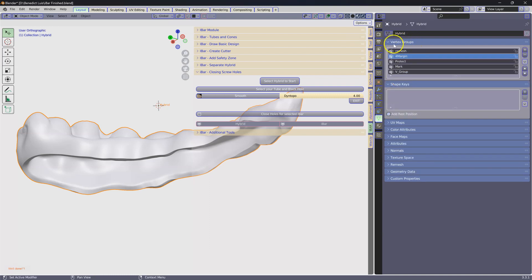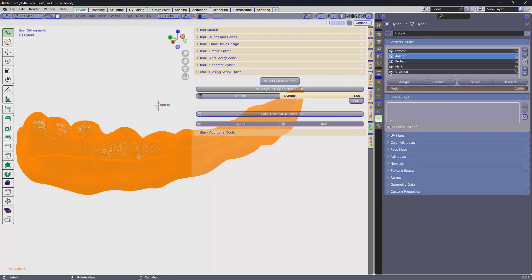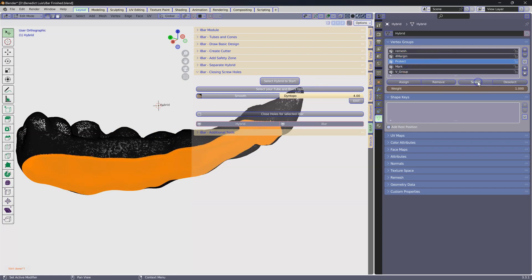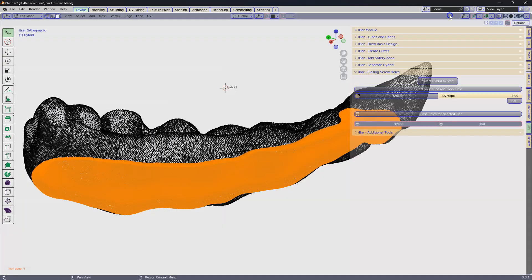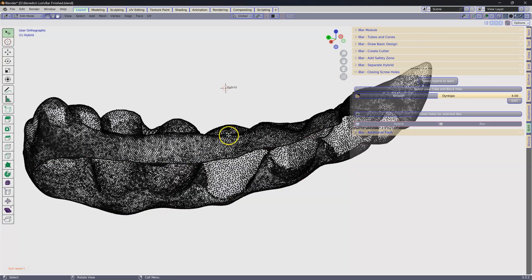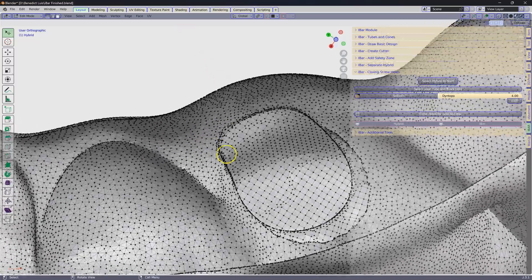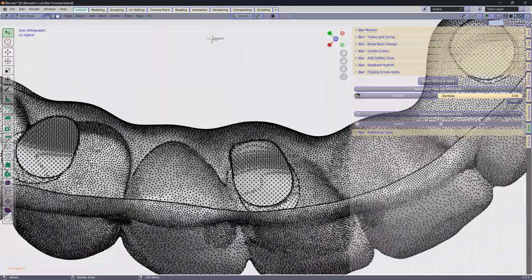These are vertex groups. Now you're going to go tab edit mode, alt A, and you're going to select the thing called protect. Then close it down. You're going to go X to delete. You're going to delete the faces, not the vertices, the faces. Now you'll see we end up with something like that.